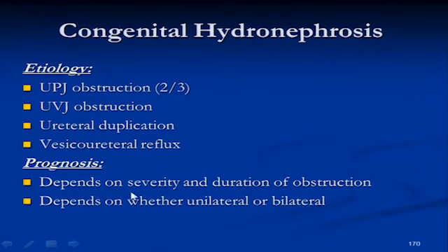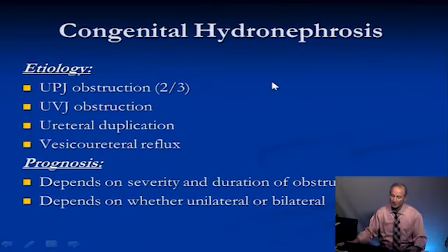The prognosis, of course, depends on the severity, but most of the mild cases have a very good prognosis, and it depends on whether it is unilateral or bilateral. There are some cases that started as very mild pyelectasis, and now we're seeing huge dilatation of the kidney. I wanted to add an image of one, but the patient came yesterday and we didn't have the time. The kidney is so huge that you can hardly see any renal cortex, so the function in that kidney is gone.